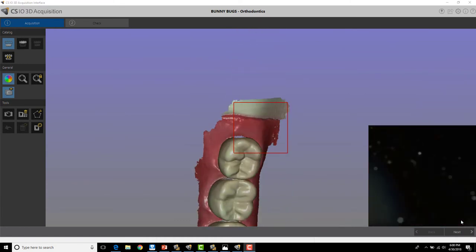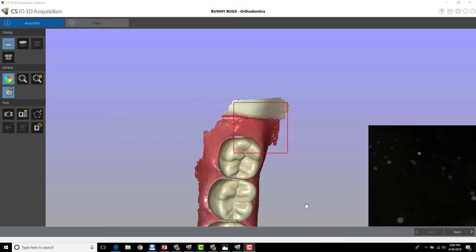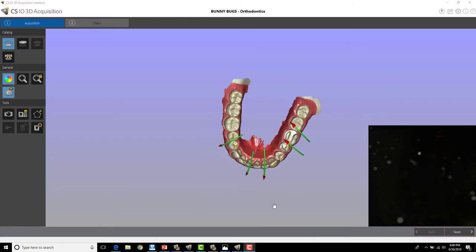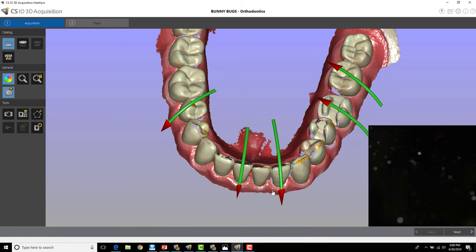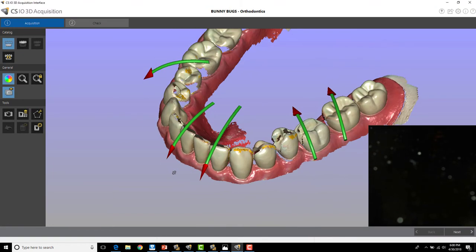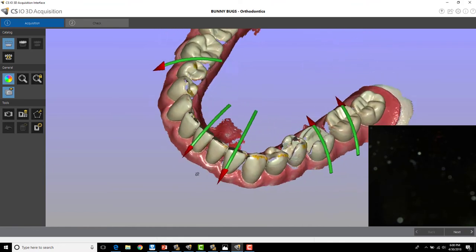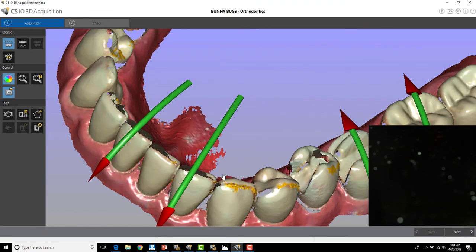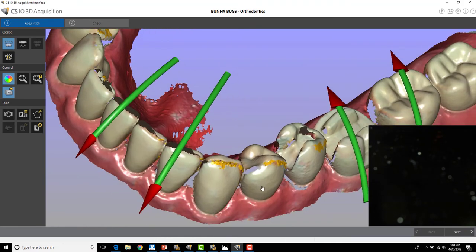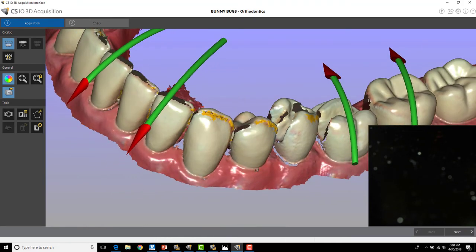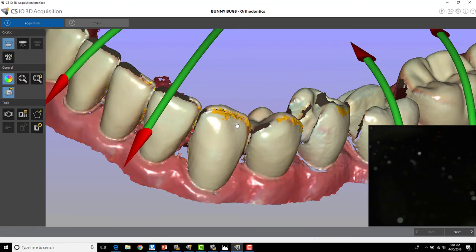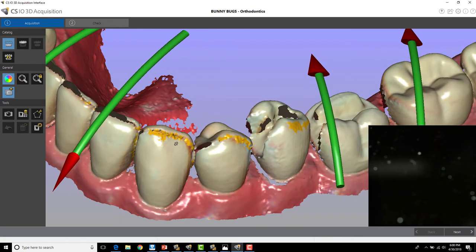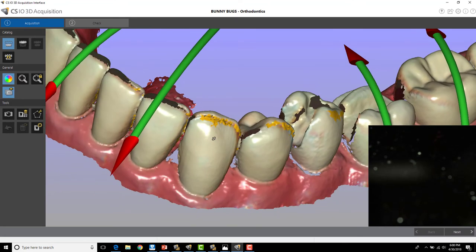The problem with that is that you're missing the incisal edge in the anterior here. And the scanner's going to pick up areas and have a harder time to mesh those together like you can see here. And those are the exact same errors that you were seeing in those couple of examples.